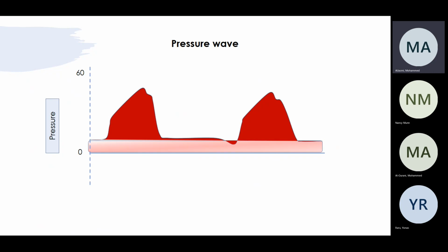So when your patient is trying to take a breath, he will use his inspiratory muscles, and the main muscle is the diaphragm. When he does that, trying to bring the pressure down, it's always positive pressure, is that right? During mechanical ventilation, it's always positive pressure, except if I have a very bad desynchrony. But in a normal person, you will see this drop in the pressure before the starting of the breath itself. That's when I know this breath has been triggered by the patient. If nothing changes in the pressure and there is a normal breath, I know this breath was not triggered.